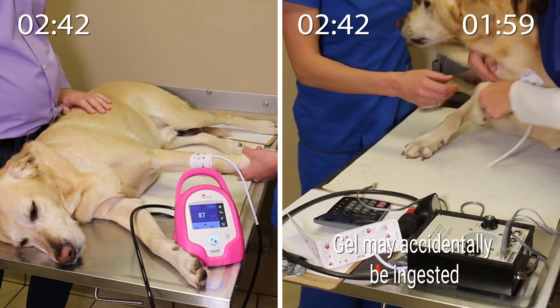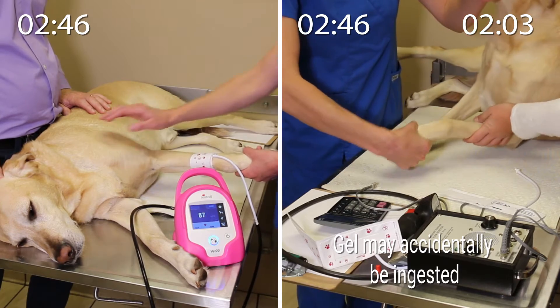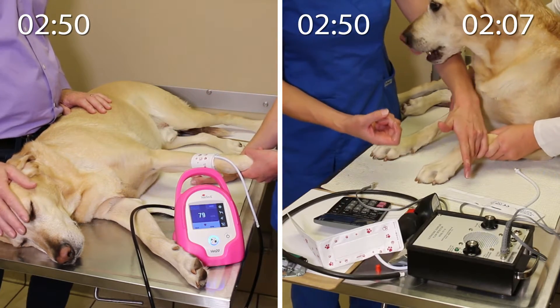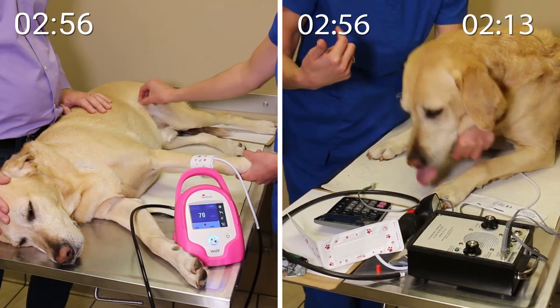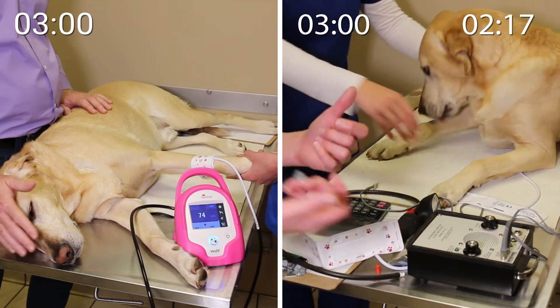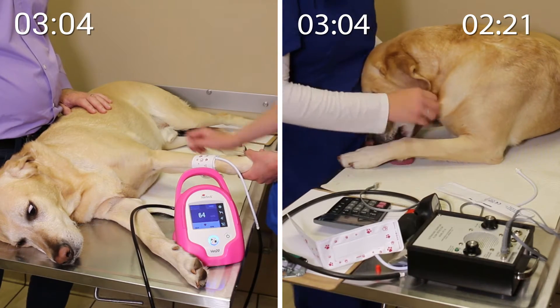As you can see, Tucker is a little unsure about all this attention. While the technicians continue setting up the Doppler, let's look back on the left side. Keeping the animal still and calm is the best way to get an oscillometric BP reading. The technician will take three readings and average them to get a value for Tucker's blood pressure. Selectable averaging can be done right on the VET20, eliminating the need for a calculator.